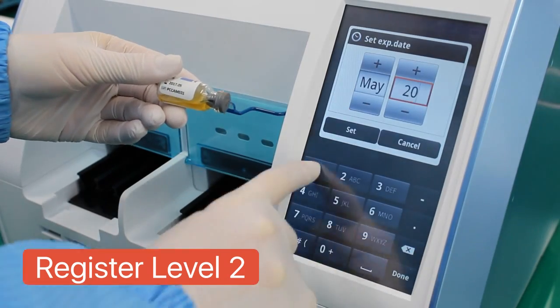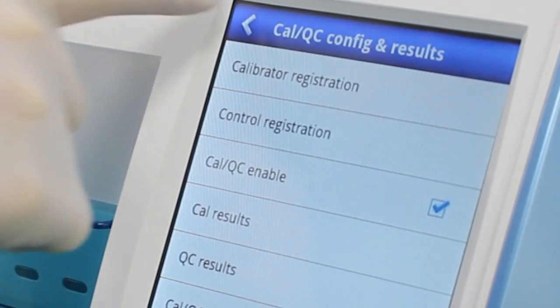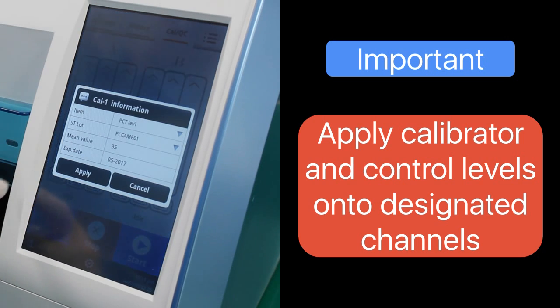After registering both calibrators, go back to the CalQC screen. On screen, apply the calibrator information on all channels as shown.